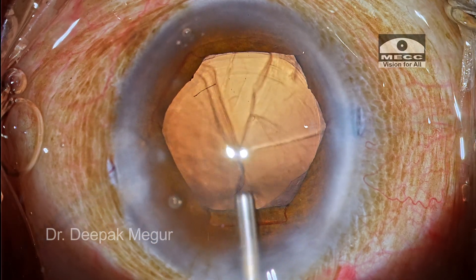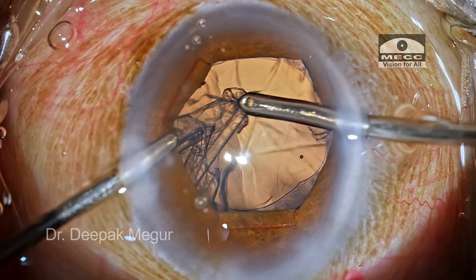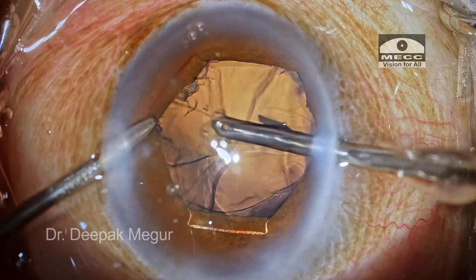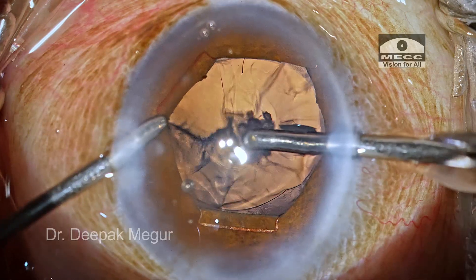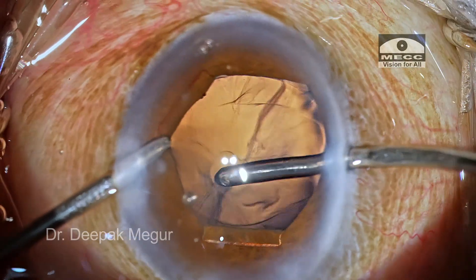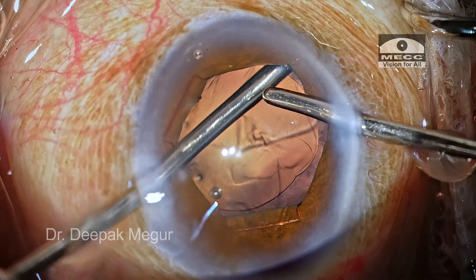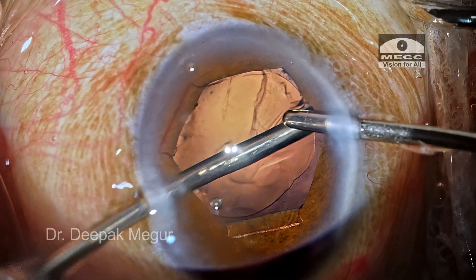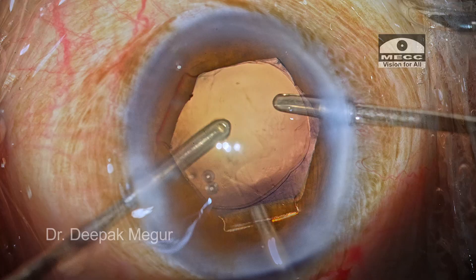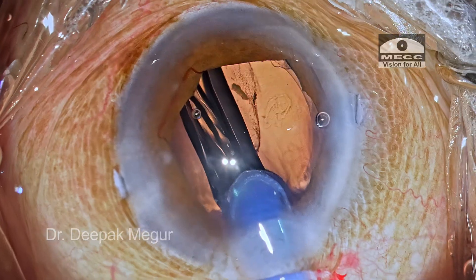Time to aspirate the cortex. One needs to be mindful when doing cortex aspiration in eyes with suspected zonular weakness — avoid engaging the anterior capsule while trying to aspirate cortex, as this can induce localized zonular dehiscence. Since the capsular bag is floppy, there's always a tendency for the anterior and posterior capsule to get stuck in the aspiration port. During cortex aspiration I did not notice significant zonular weakness, so I did not place a CTR. The bag is inflated with OVD and a single-piece hydrophobic IOL is placed inside the bag.